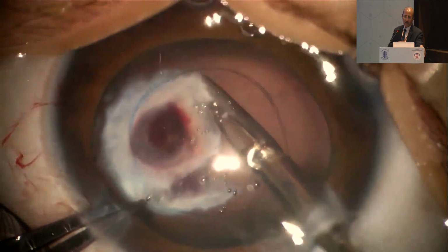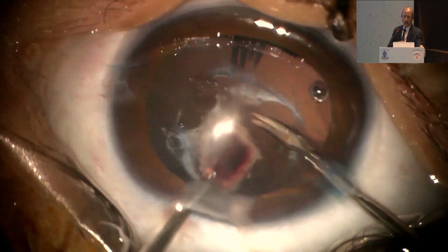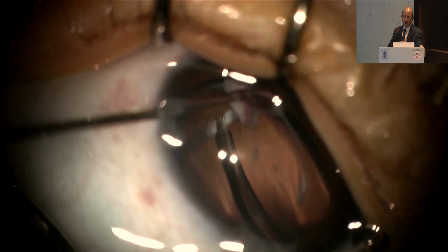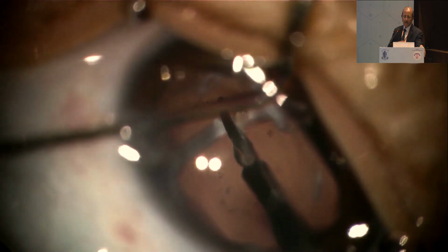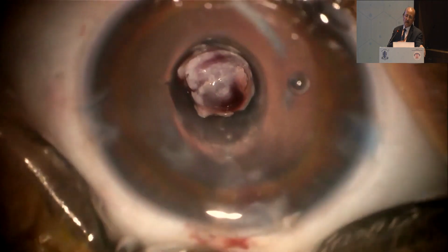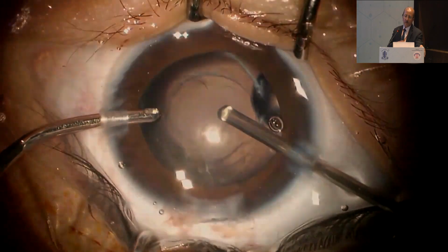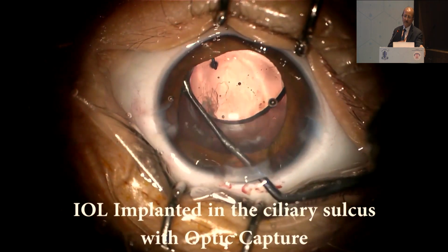Difficult to cut with the vitrectomy cutter, but it is quite a thick membrane, and this is cauterization of the stalk, and removal of this stalk so that there is no bleeding after cauterization, and placement of the IOL. Because it may be difficult to place the IOL directly into the bag, the optic is captured into the capsular bag.